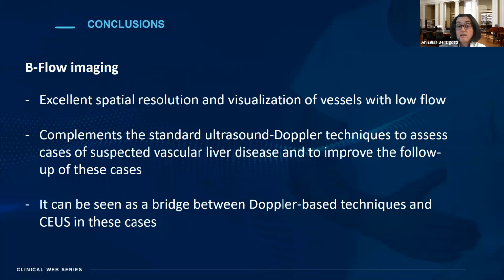And I think it could be seen as a bridge between the Doppler-based techniques that remain fundamental in our clinical practice and shifting to our next step, that is using contrast-enhanced ultrasound to prove or rule out thrombosis, for instance, in these cases, or perfusion.